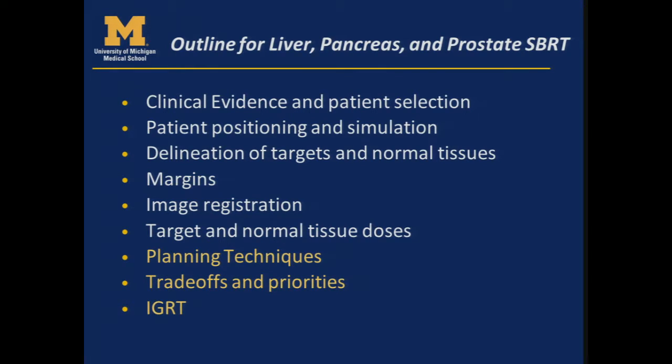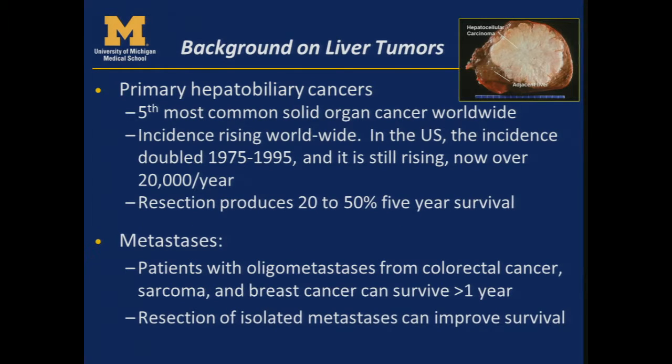And then I'll hand it over to Martha, who will talk about planning techniques, trade-off priorities, and IGRT, and all the technical considerations of planning. So a little bit of background on liver tumors, because it's not that common for patients to be treated with SBRT for this still worldwide.